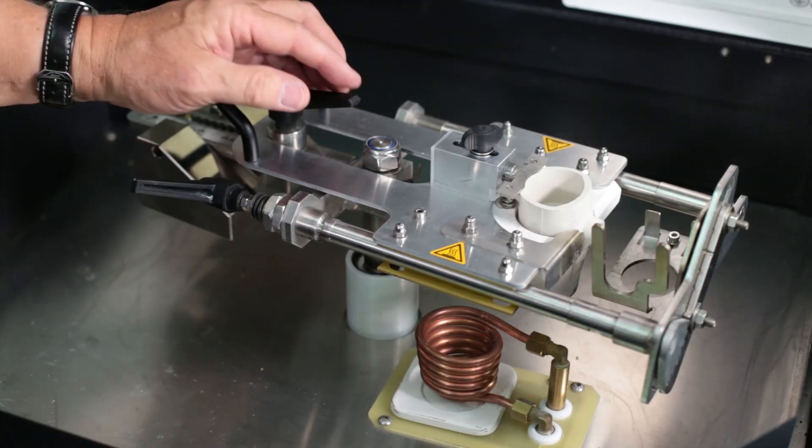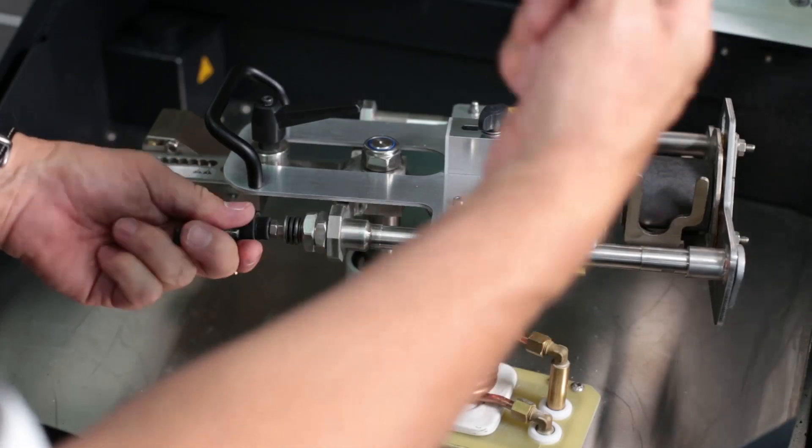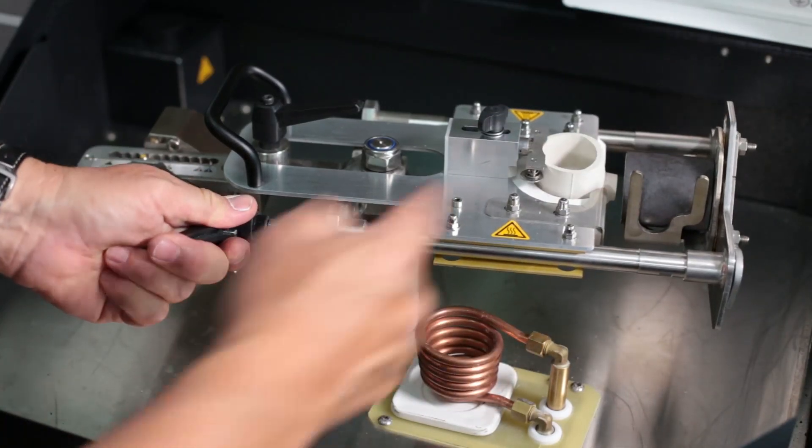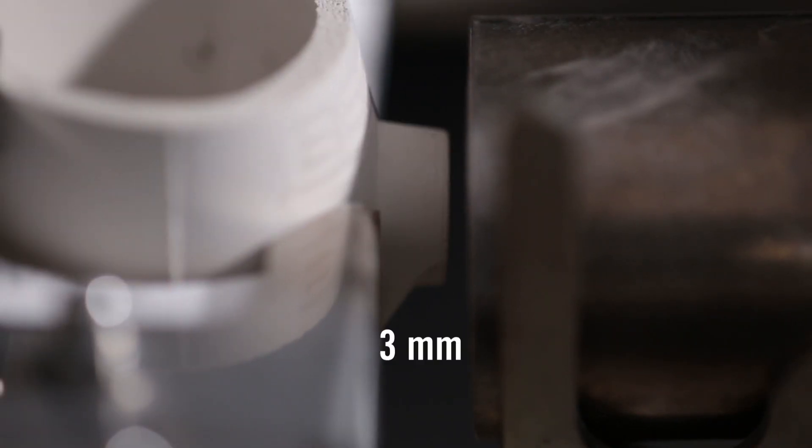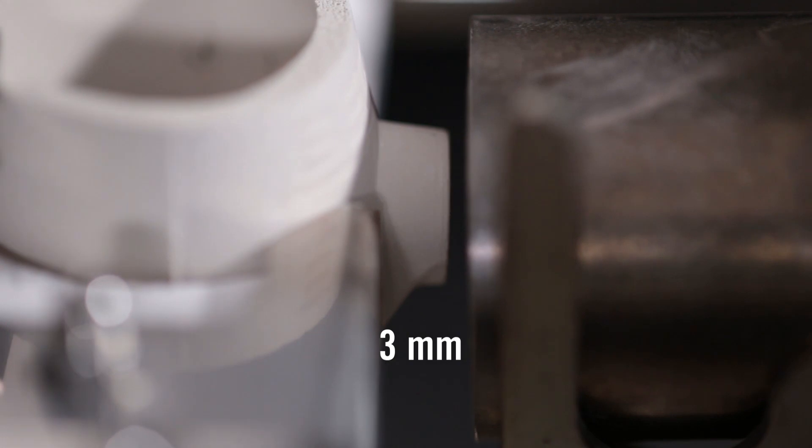In preparation for the casting, the position of the mold can be optimally adjusted with the aid of a test mold, so that the alloy can flow directly into the mold after the casting has been triggered. A distance of 3 mm between the top of the mold and the ceramic crucible receiving plate should be kept.